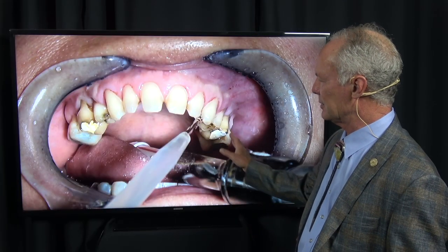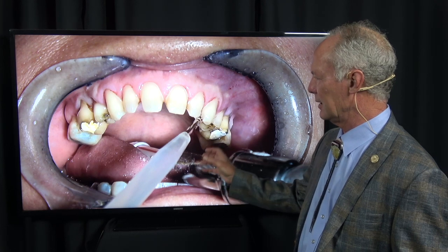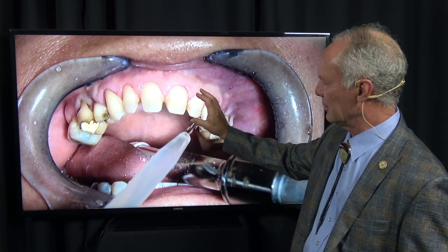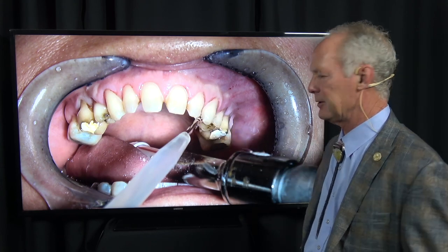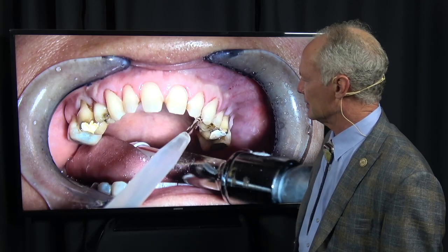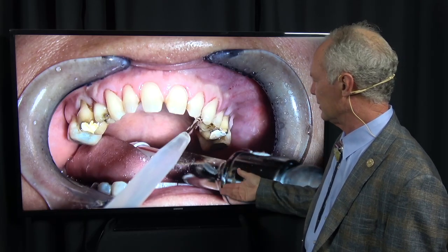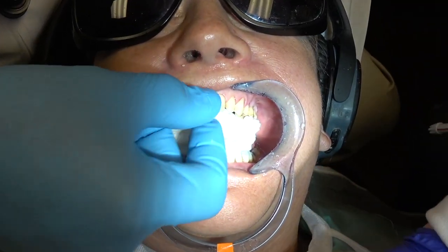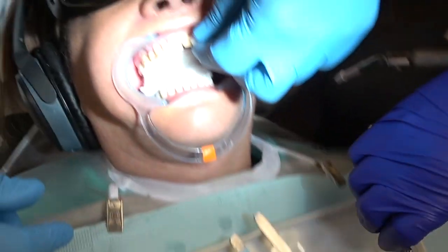The second time I'm rinsing with cold water in a water bottle. I don't want to put a lot of pressure on that gingival tissue because the patient hadn't been able to floss their teeth while in the provisionals, and the gum tissue is going to have a tendency to bleed. So I rinse with a water bottle of cold water. If there's some bleeding, 38% phosphoric acid for 45 seconds will control that.